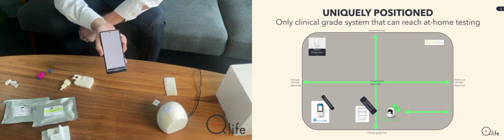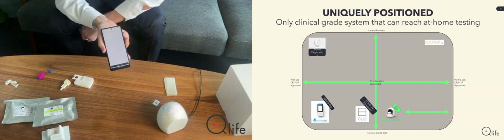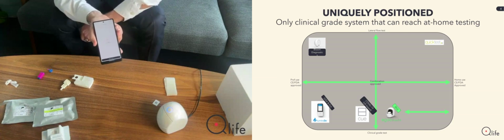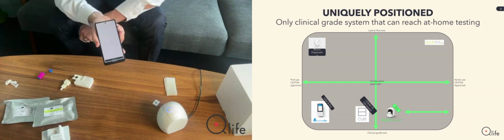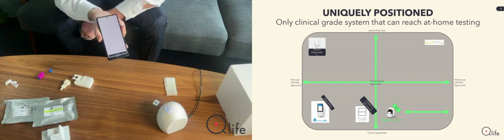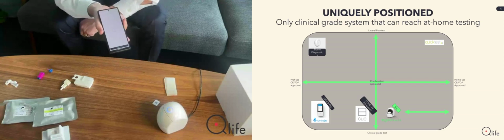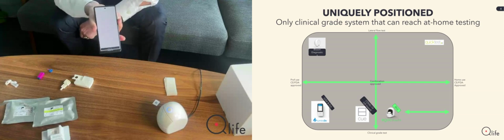And the range that we are measuring is between 1 to 200. So 1 is the absolute lowest, and that's why it says below 1. We are delivering quantitative data. So that means if my level was higher, it could, for instance, say 5.4 or 25 or something like that. The higher you get, obviously, the worse it is. Of course. And when we talk about low-grade inflammations, it's typically between 10 to 20, which means you have a certain level of inflammation in your body, but you would not be categorized as being sick.